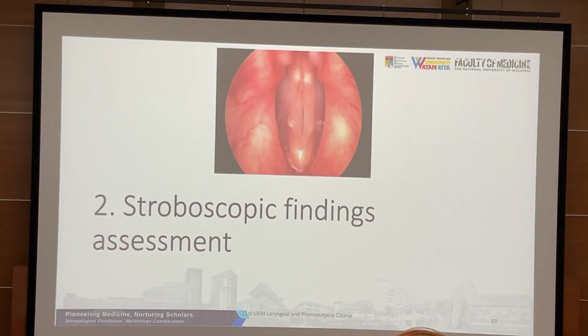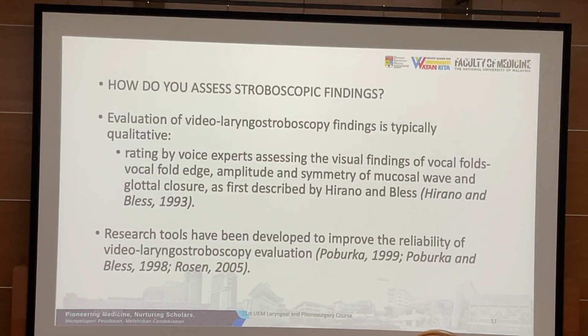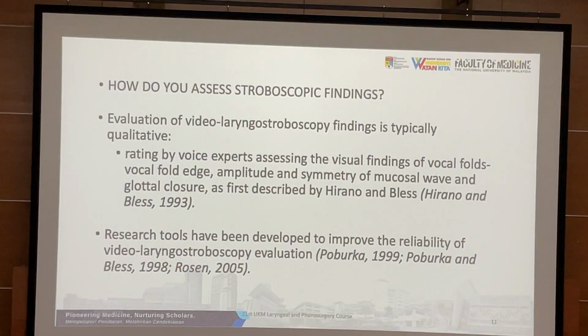And when I assess, and then the same patient is assessed by Dr. Yakubu in London, how do we communicate to assess the mucosal wave or the stroboscopic findings? It is all very subjective, and it depends on the eye of the person who sees the mucosal wave and how many stroboscopic examinations you have done. So to minimize the bias, people have developed some tools to standardize the way we assess the mucosal wave.